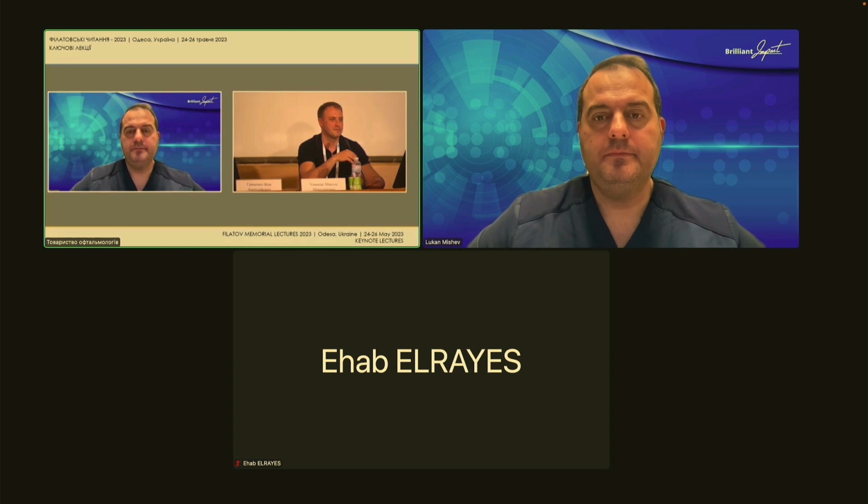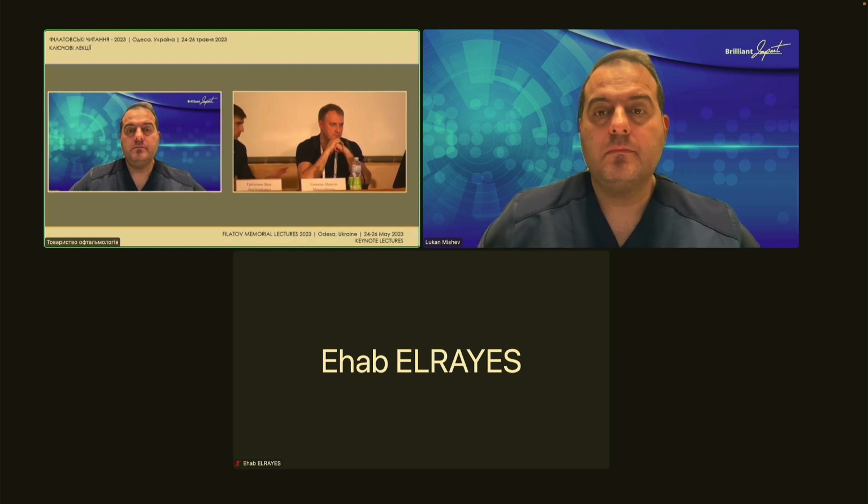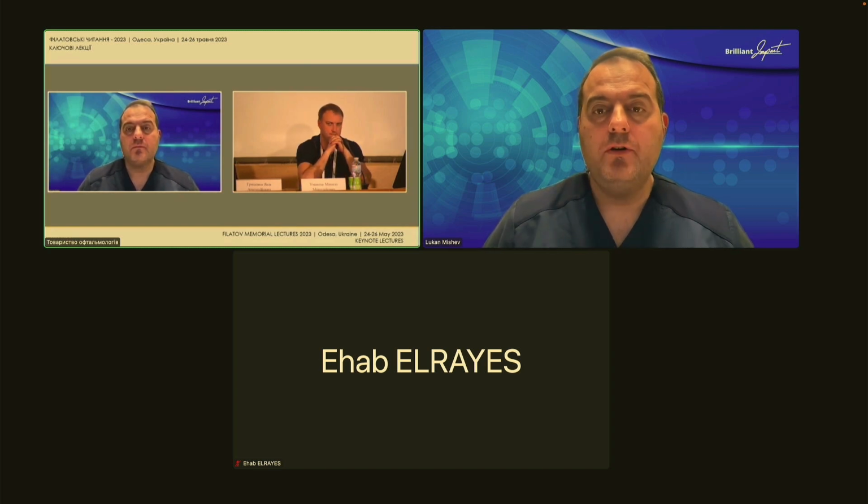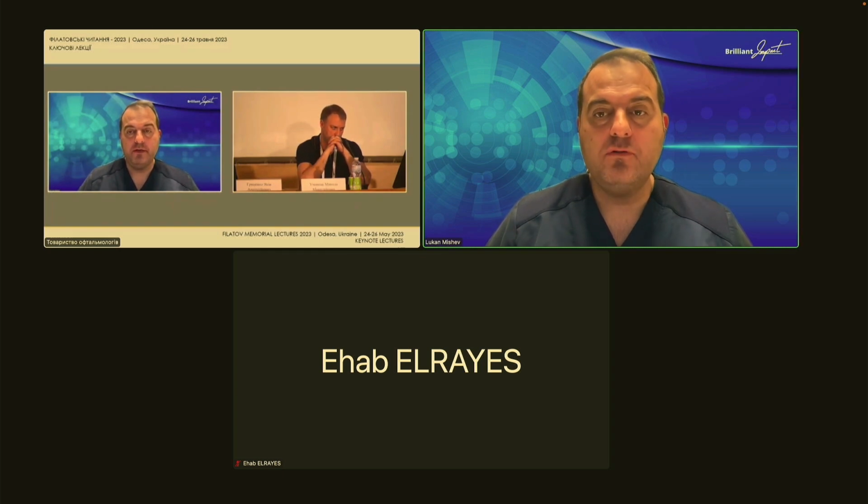Just one technical question, it might have escaped my attention, but I'm curious how these digital filters are produced. I imagine that an LED light source is used in the system with red, green, blue light sources, and that the filter consists of a mix of those 3 light sources, correct? No. It's a composition of 2 components. The first one is the endo-illumination. In my case, I use a xenon light source.